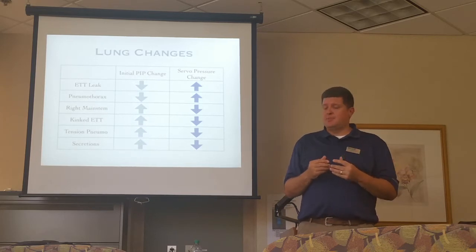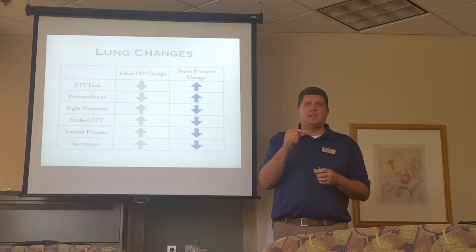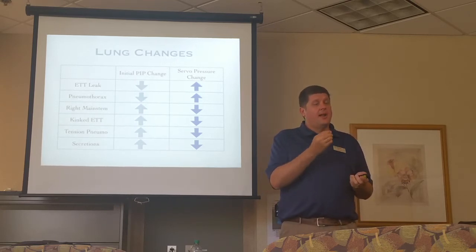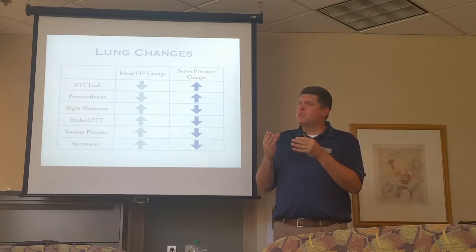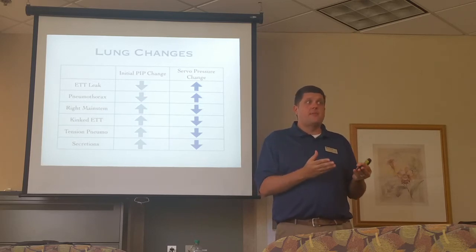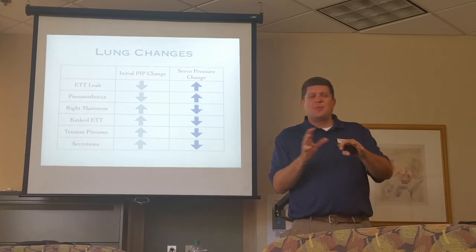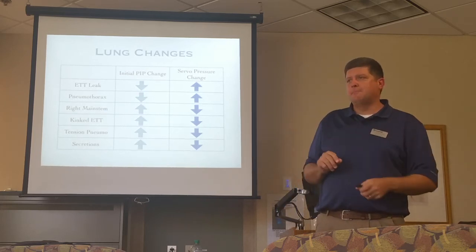And I'm telling you, a lot of times, just a simple repositioning, get things back midline, maybe just a slight turn of the ET tube, oh, then all of a sudden you got chest wiggle again and the servo pressure comes back up to where it's supposed to be, okay? So I know it's on your chart, and I know we chart and document it, but get to know with your patients day to day what their baseline is, and that should be part of our shift report. It's not just the settings that they're on, but know that, hey, today his servos have been running 2.3, 2.4, so that you have that established baseline of where it's supposed to go.